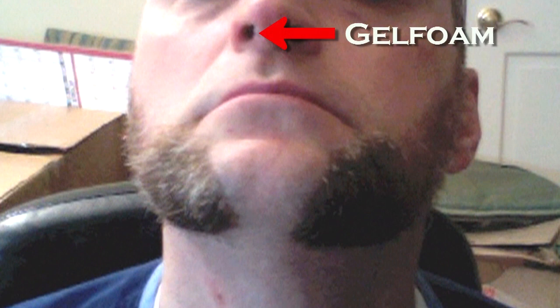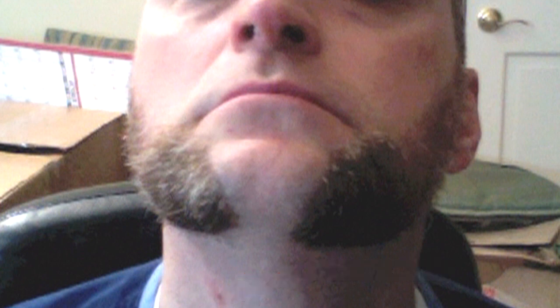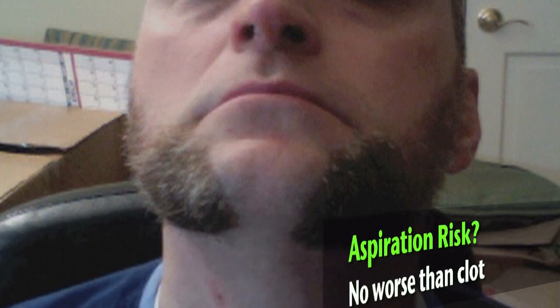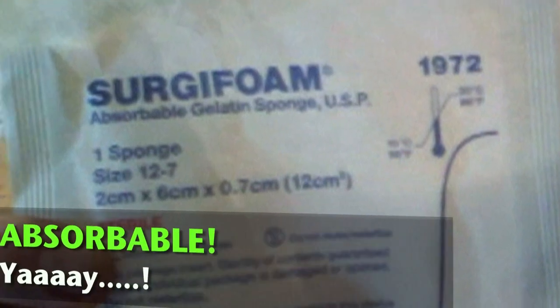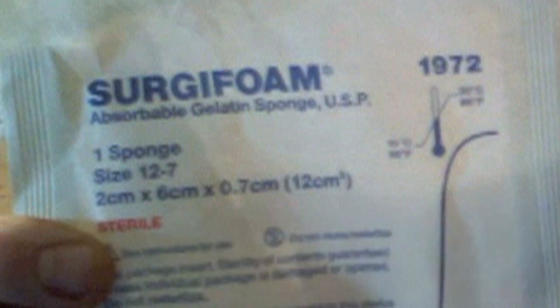What if it falls off? What if it gets loose and the patient aspirates it? Well, I don't think the aspiration risk is any greater than that of just aspirating a regular blood clot from someone's nosebleed. And we've all seen patients cough those up over and over. And gel foam is absorbable, so even if it got aspirated, you wouldn't have to go after it with a bronchoscope the way you would with gauze, because the gel foam would just be broken down by the body over time. At least that's the theory behind this.